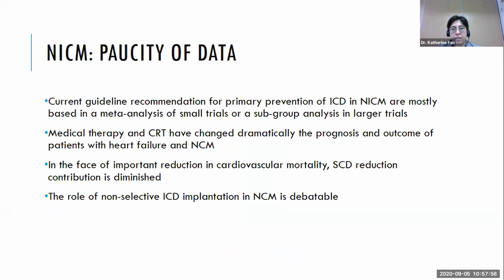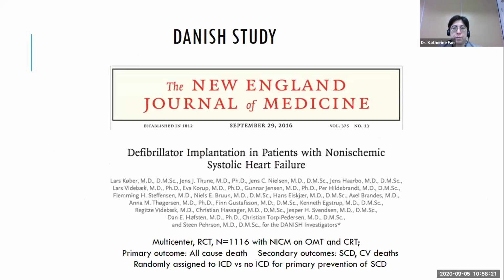Medical therapy and CRT have changed dramatically the prognosis and outcome of patients with heart failure and non-ischemic cardiomyopathy. And in the face of important reduction in cardiovascular mortality, the sudden cardiac death reduction contribution is diminished. And the role of non-selective ICD implantation in non-ischemic cardiomyopathy, sorry, my typo, is currently debatable. This comes from the DANISH study.